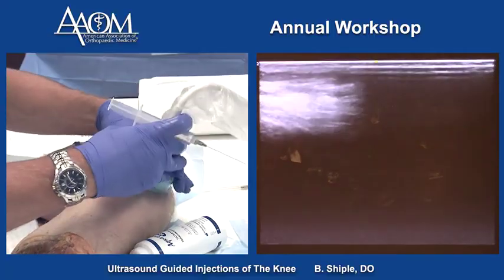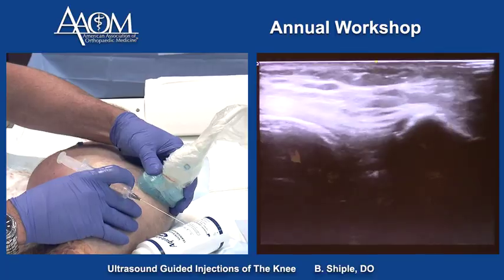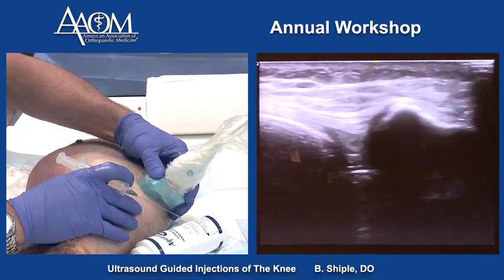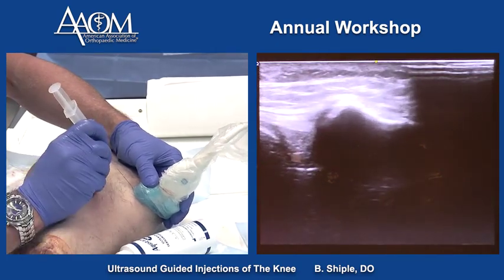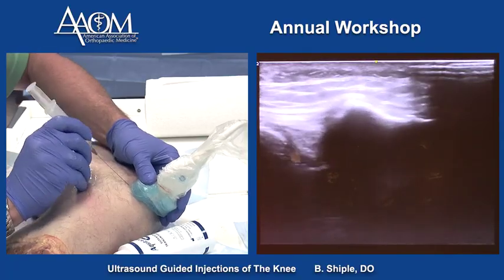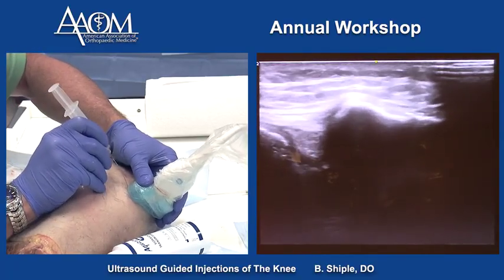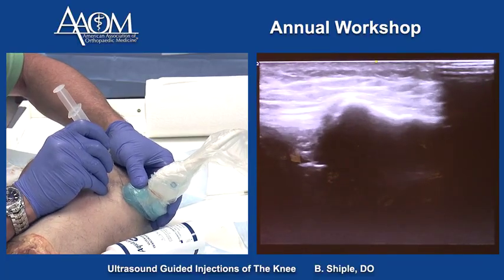We can also inject the MPFL on the medial patella. There's the patella, and that's the MPFL right there. We slide the probe away to get the target closer to the probe and go in long axis — and that's it right there.